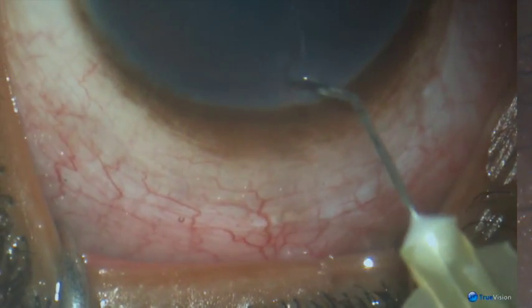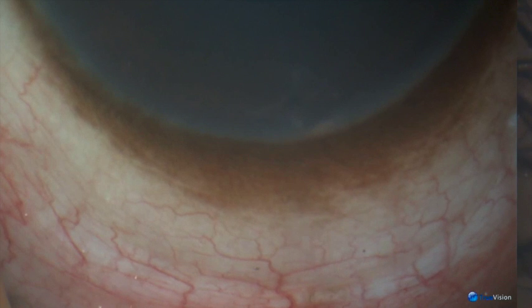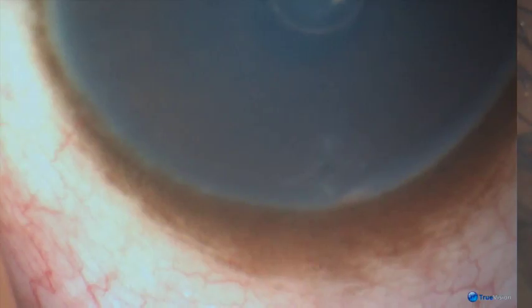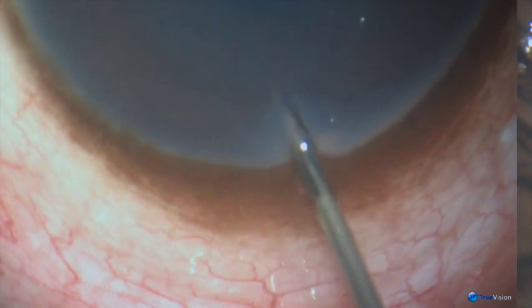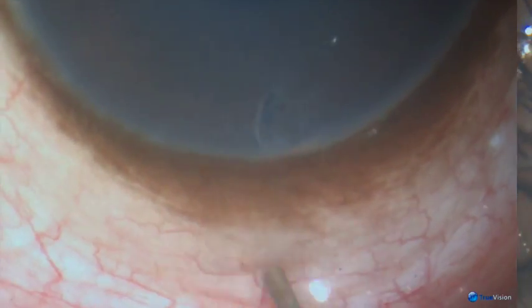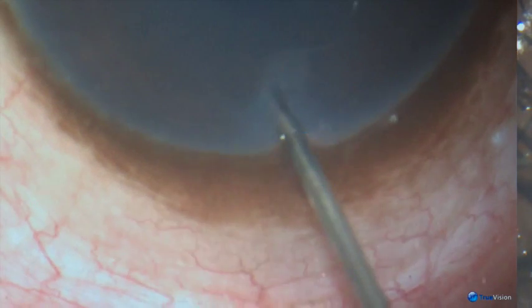Doing a peripheral iridectomy through the vertical corneal incision, then irrigating out the pigment. Again irrigating and defining the peripheral iridectomy.